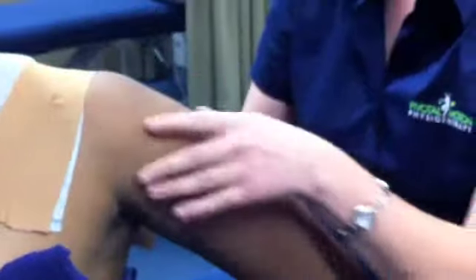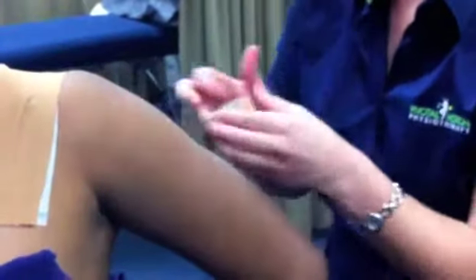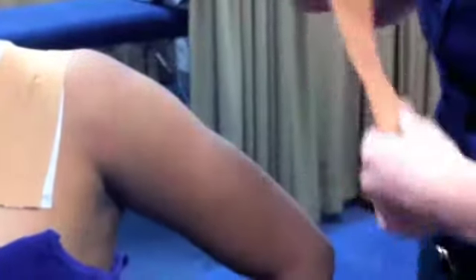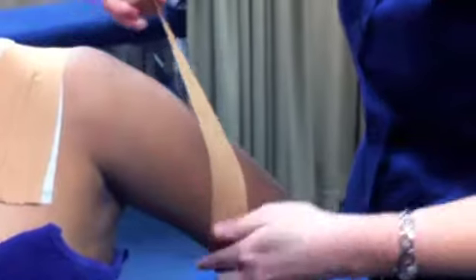Position the shoulder in slight elevation with the patient's hand on the hip — the thumb should face backwards. Ensure that the patient's scapula is in a retracted position prior to applying the tape distal to proximal, as shown.